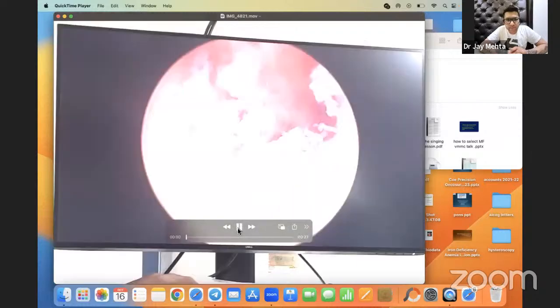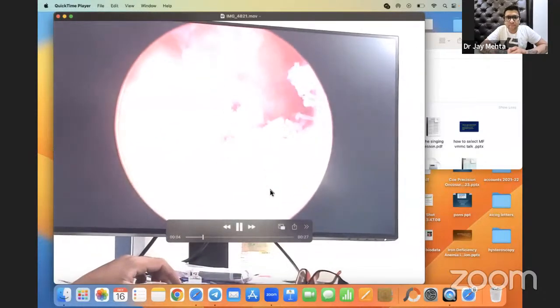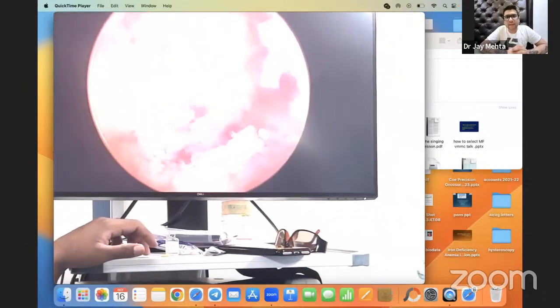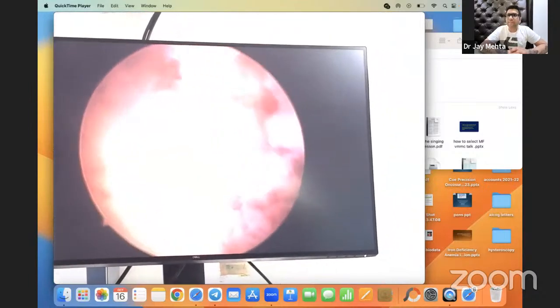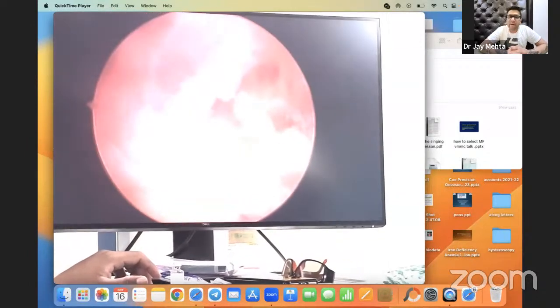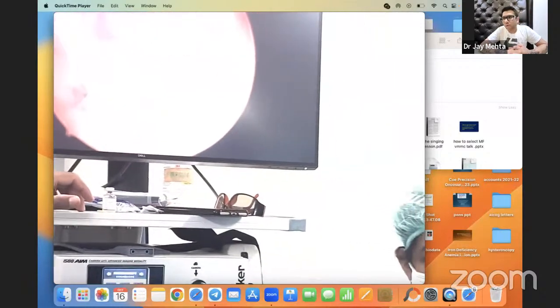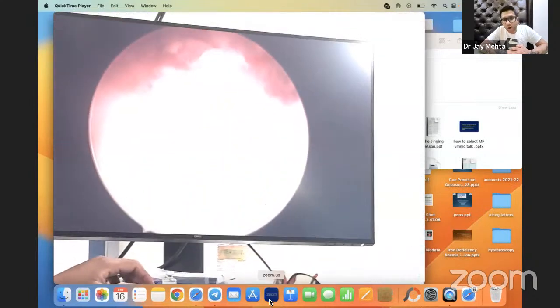The video is a little whitish, madam. Yeah, one can see those micro polyps there at that angle, right? It is these micro polyps which are very, very typical of chronic endometritis. So if you end up seeing them, it is important that these patients do get treated with a course of antibiotics prior to you planning your embryo transfer on all of these patients.